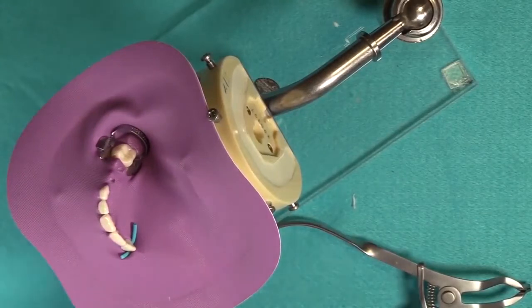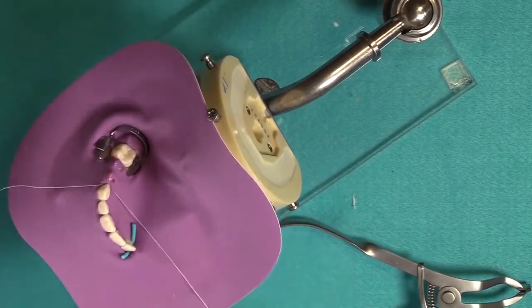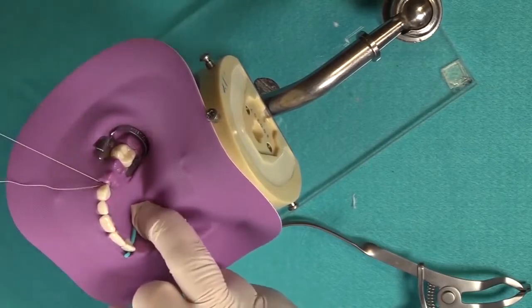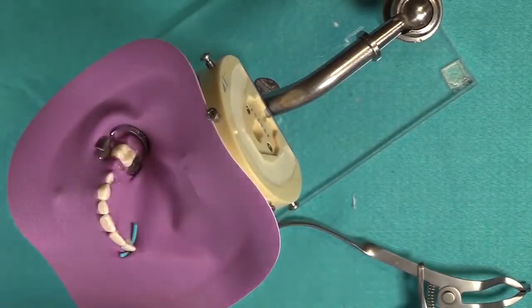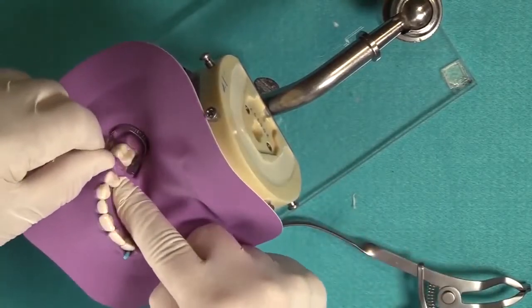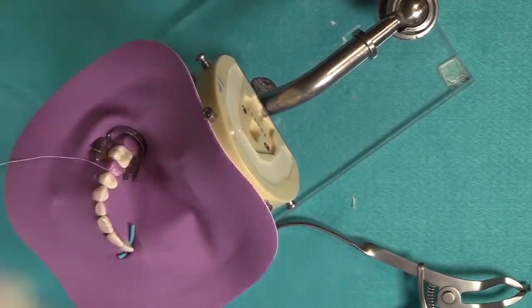So what I'm going to do is a combination of a knife edge concept with using floss. Now I'm going to use my floss to line up the edge and gently bring it through the contact. This is called the loop technique because I'm looping the floss and I'm going to bring in a little bit more material with me. Notice? And then I'm going to pull this out through the facial. Okay, I'm going to have to repeat the process because I'm not thoroughly through the contact yet. Again, there we go. And there. This is called the loop technique. Now I'm going to go on to the next. Taking a little bit more in. You're basically feeding it in gradually. And the lubricant is facilitating this as well, you see?